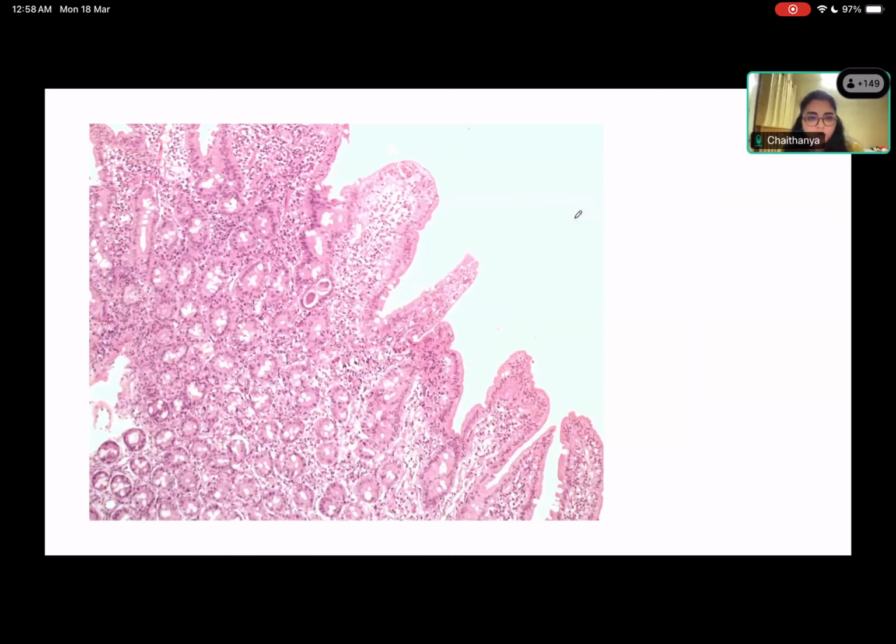It shows a duodenal biopsy with dense lamina propria showing dense eosinophilic inflammatory infiltrate. Along with that, one crypt is showing eosinophilic material, homogeneous eosinophilic material. Sort of parasite. It could be parasite, I thought. Correct. Correct. Very good. This is parasite. Yes, ma'am. So this is parasite.